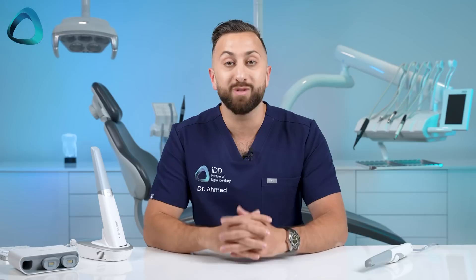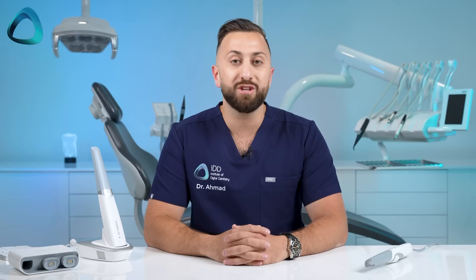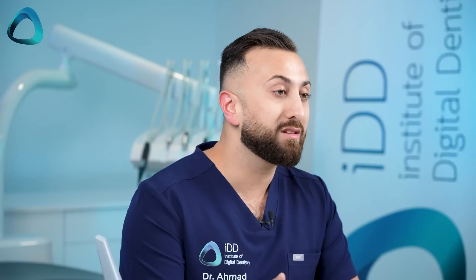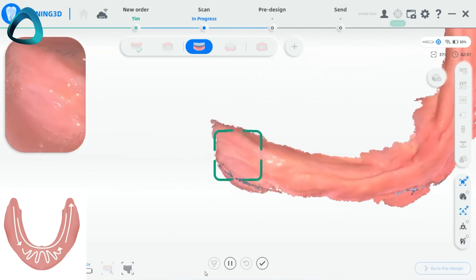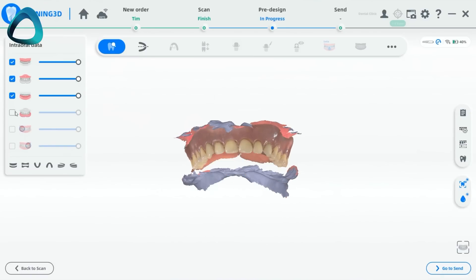Long story short, it scans well, which is really an expectation in the scanner market in 2024. I've been using the previous generation ARL Scan3 and now the wireless for basically every dental indication — crowns, bridges, implants, smile makeovers, partial denture scans, full denture scans, etc. It does a good job for basically every dental indication. This is a capable scanner. The company has really worked on their software workflow, improving denture scanning, including copy denture workflows and scanning wax rims. Overall it's decent for denture scanning, but this is an area that still needs improvement.